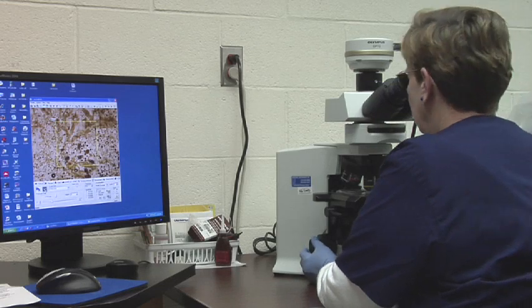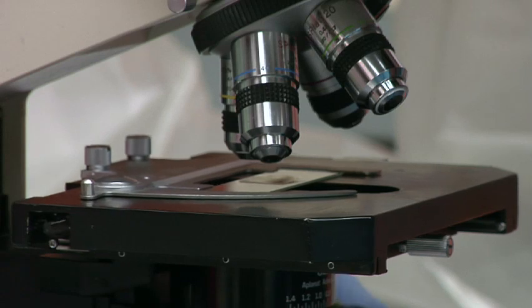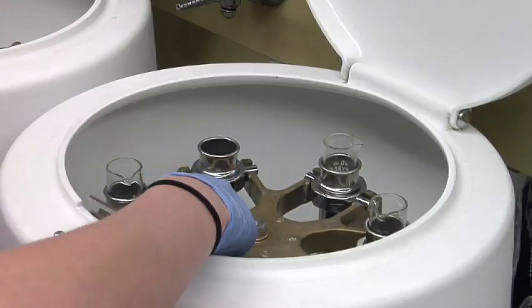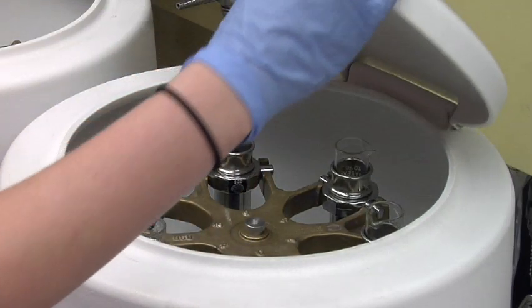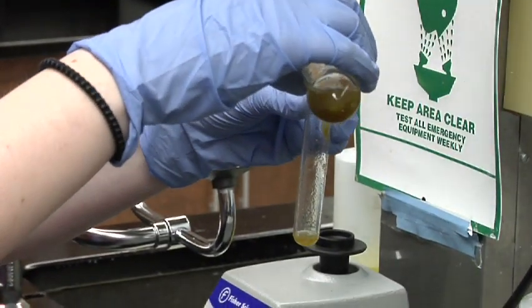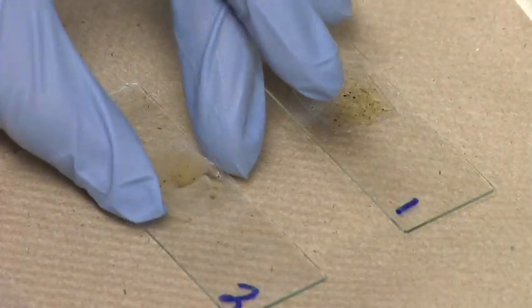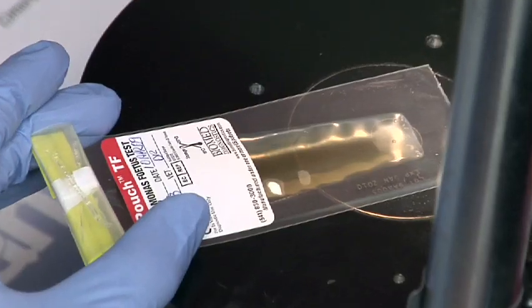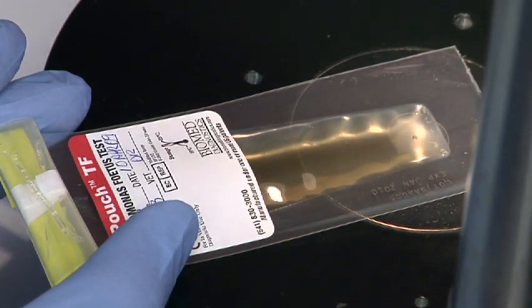The parasitology lab is responsible for the identification of external and internal parasites. Because many of the different types of parasites that dogs and cats have are zoonotic, we need to be able to correctly identify them, which is very critical for the health and the well-being of the pets. On the large animal side, the intestinal parasites could cause a big economic loss due to severe infections. Available diagnostics include routine examinations as well as specialized tests, such as trichomoniasis in cattle and cats.